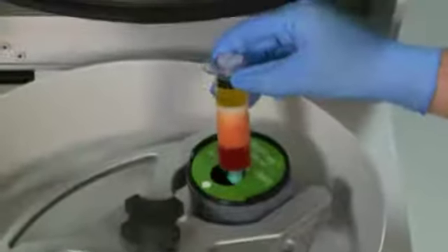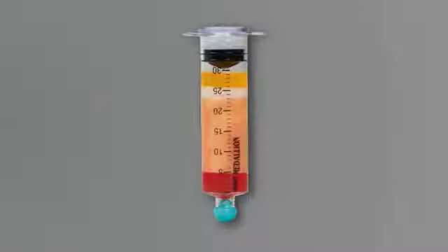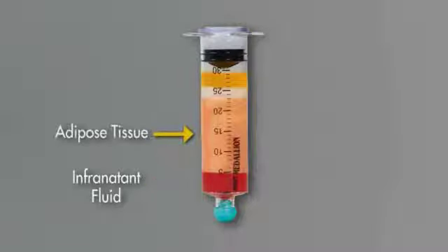The lipoaspirate sample will have separated into 3 discrete fractions after processing. The infranatant fluid, present on the bottom layer closest to the green tip cap. The concentrated adipose tissue, present in the middle layer. The lipids, present on the top layer as a bright yellow fluid just above the floating lipid barrier disc.